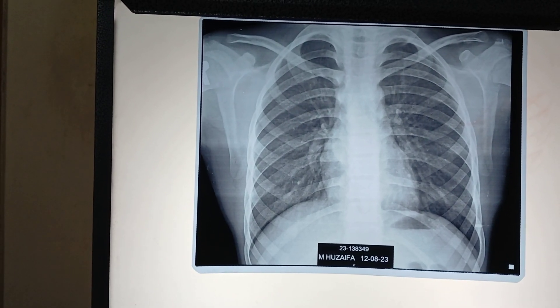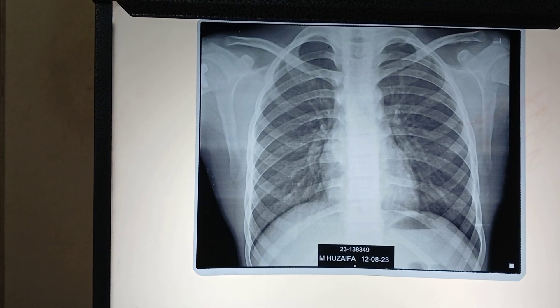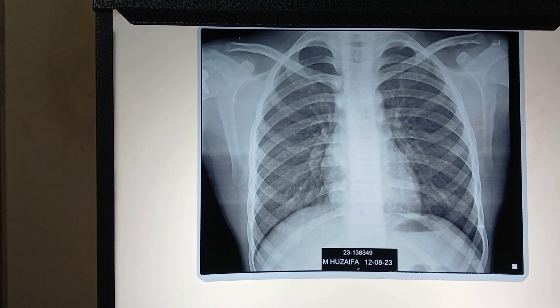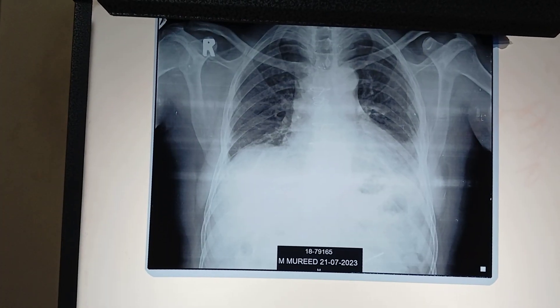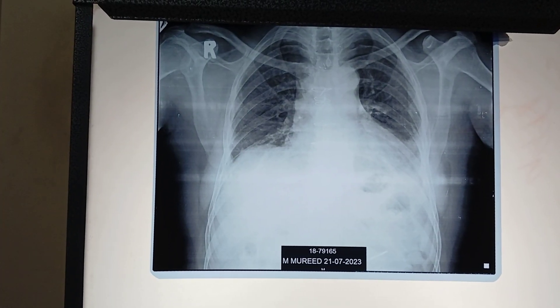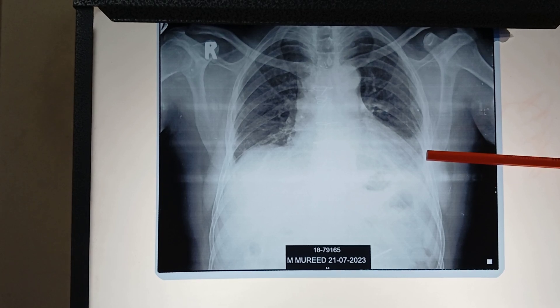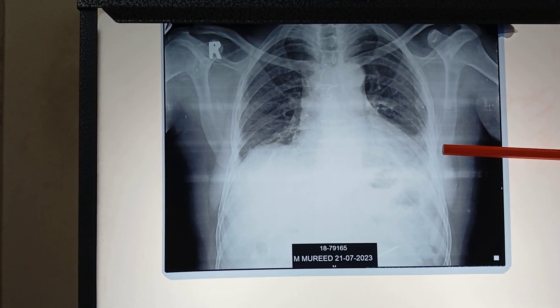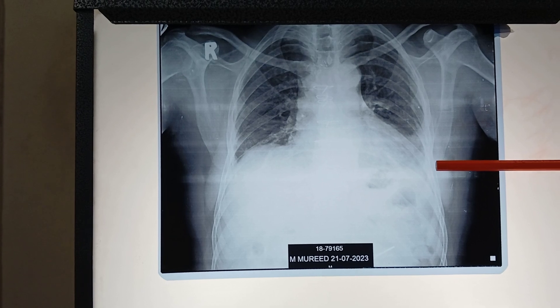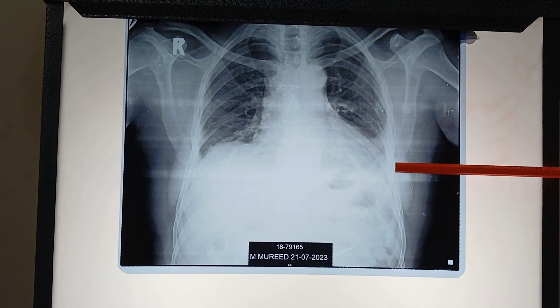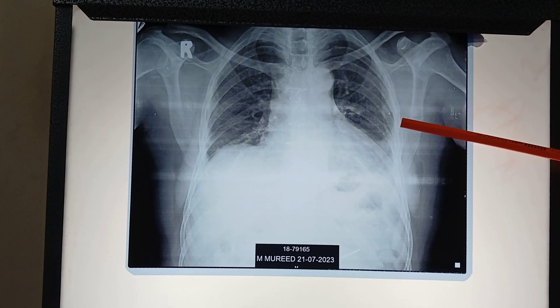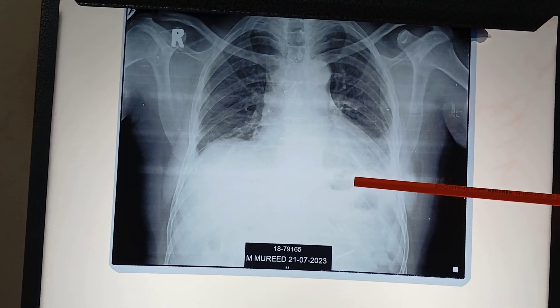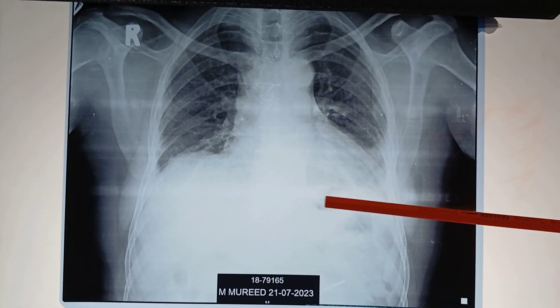This is all about the basics of a normal chest X-ray. Now I will show you some pathologies. This is a chest X-ray in which a homogeneous haze is seen along the left hemithorax, obscuring the left CP angle, cardiac and diaphragmatic silhouette, and extending along the left lateral chest wall. So this is a case of pleural effusion, seen as this opacity.